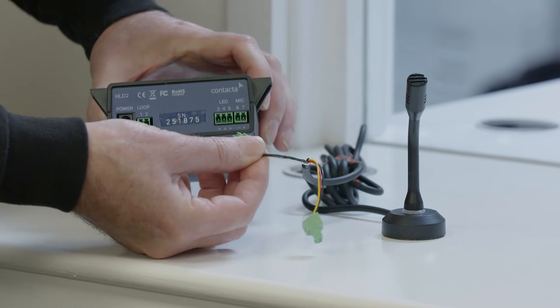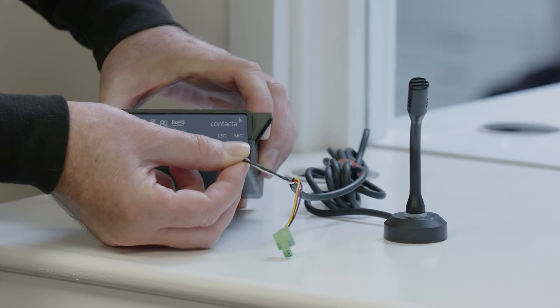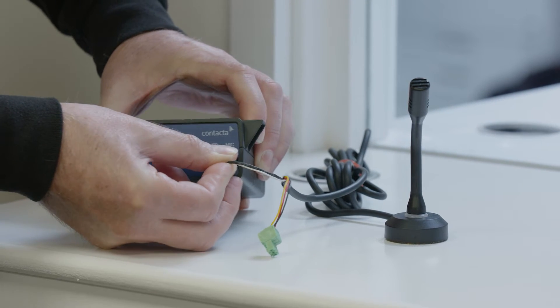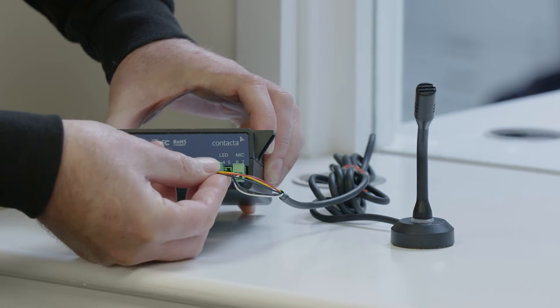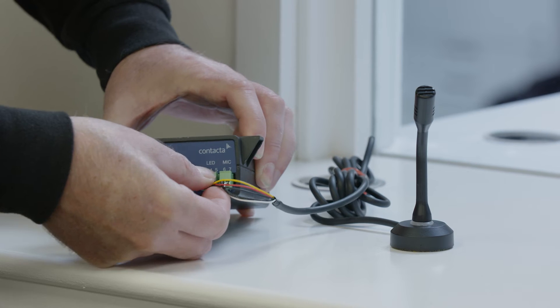Connect the microphone connector into the microphone sockets labeled 6 and 7. Take the LED connection and insert it into the LED sockets labeled 3, 4 and 5.